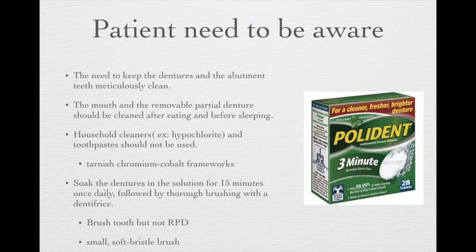However, patients still need to use a toothbrush and toothpaste to clean the natural dentition. So it's very important to remind them that they have to brush the teeth, but not brush the RPD with toothpaste. When they use a brush, they should select a small, soft-bristle brush to prevent the brush from hurting the soft tissue.